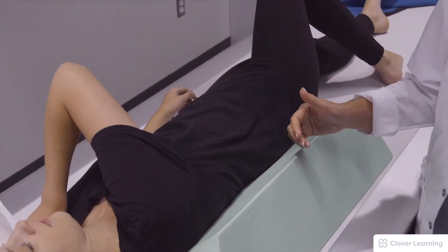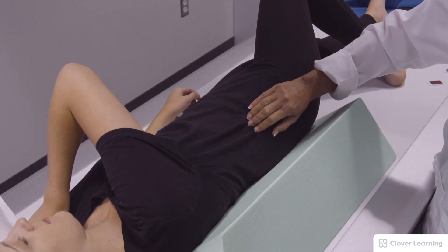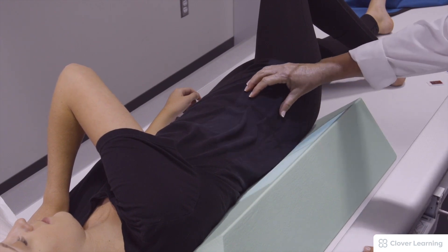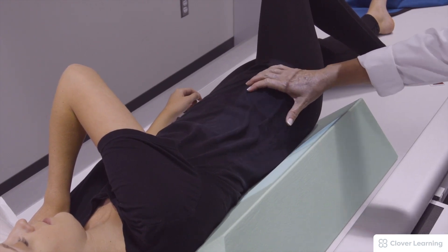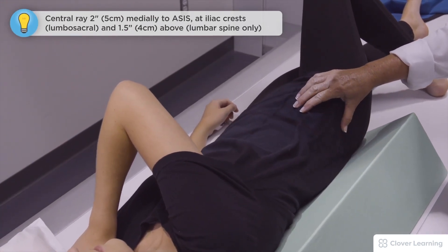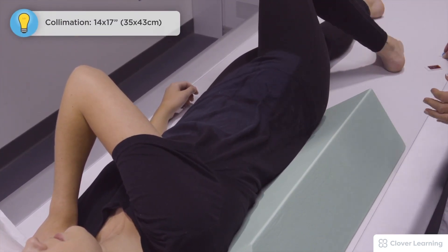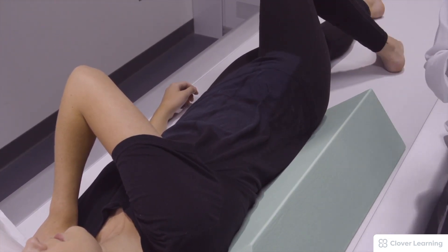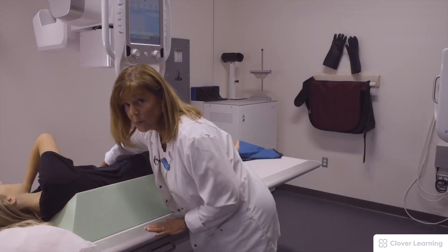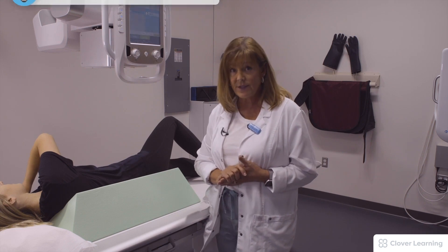We're going to use those same landmarks, either at the crest or an inch and a half above, and then two inches medial to the ASIS. She's rolled to the left so I'm going to use a left marker on the left side. We will again see the Scotty dogs on this view.